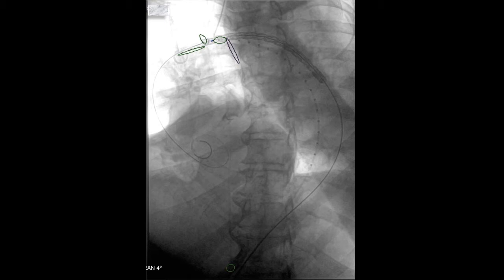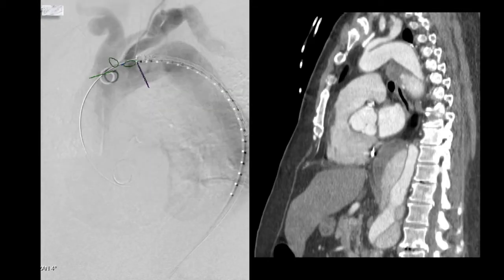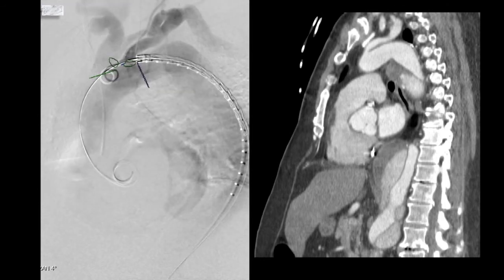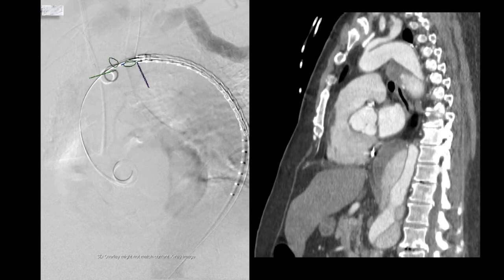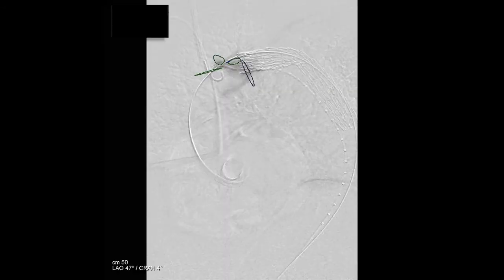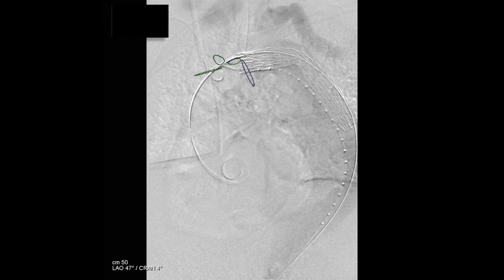Here you can see we've been fairly aggressive with the fusion marks representing the aorta in red, the left subclavian, the left carotid, and the larger origin of the innominate in green marks. Once we get this in place we'll confirm positioning. The flanges and tip of the excluder are just at the origin of the left subclavian artery, which is where we're going to deploy this. The device was not particularly angulated, so we did not feel we needed to angulate the proximal end.